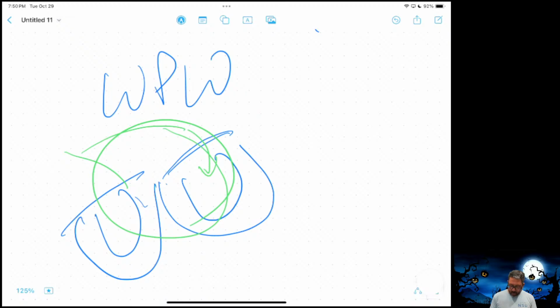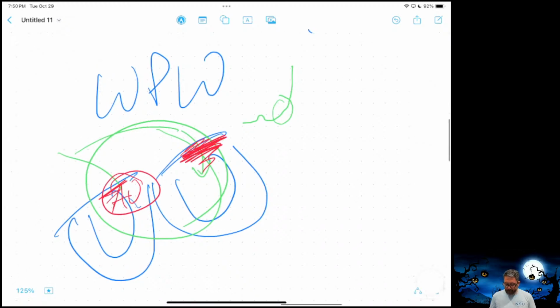And the way you can tell that is because on the QRS complex, when it starts, here's your P wave, there is a slope to it. That slope is because this area is depolarizing faster than this area where the AV node is. This is going a lot faster.